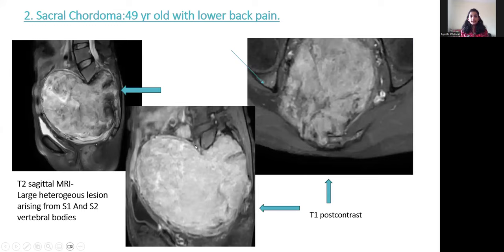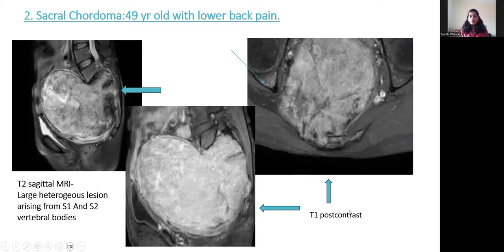Second case: sacral chordoma in a 49-year-old female with lower back pain. T2 sagittal MRI shows a large heterogeneous lesion arising from S1 and S2 vertebral bodies, causing compression over the urinary bladder and uterus anteriorly. T1 post-contrast shows strong post-contrast enhancement with involvement of the right side of the hip bone.